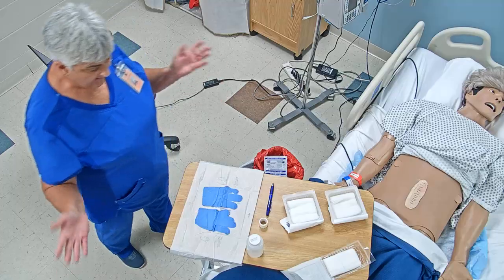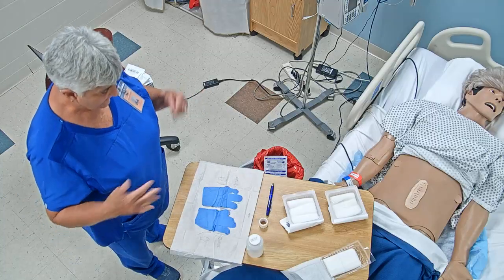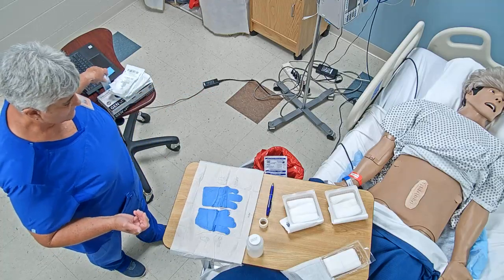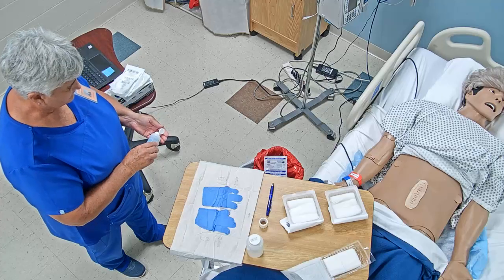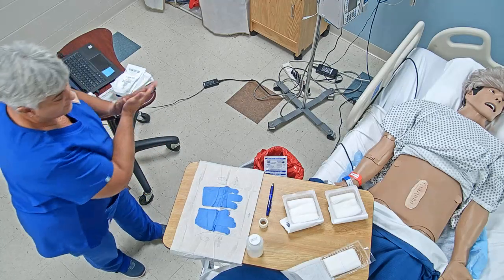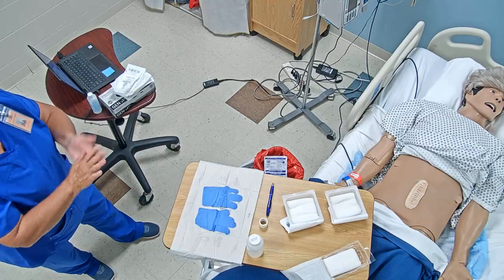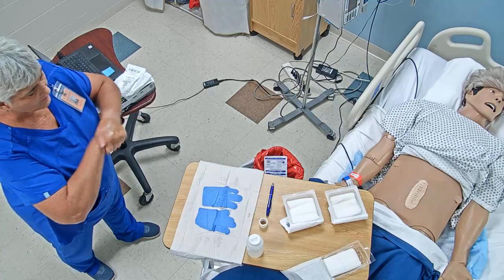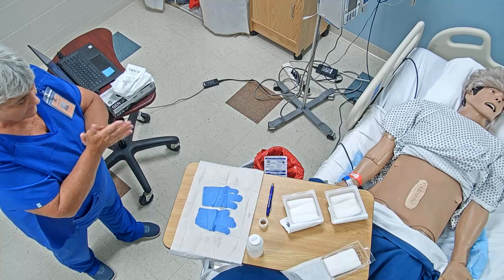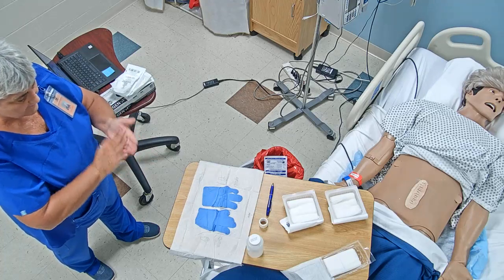Now I want to make sure the package doesn't fall back on itself, because if it does, then it's considered contaminated, and I would just need to open a new pair. So just to make sure, I'm going to go ahead and, if I'd already done one, making sure I'm not turning my back on my sterile field. But I've just opened up sterile supplies, and I got a lot of that on there this time, so I'm going to have to rub it in there till it dries. Okay.